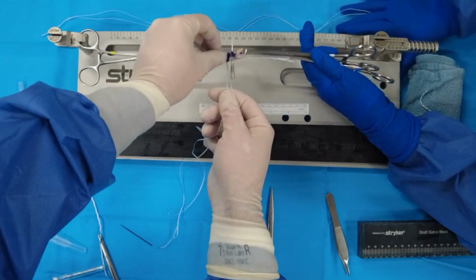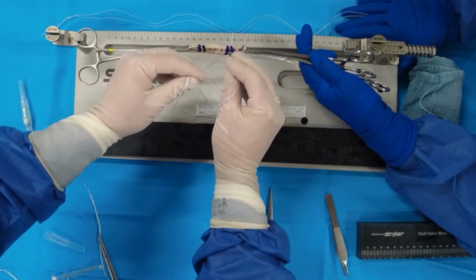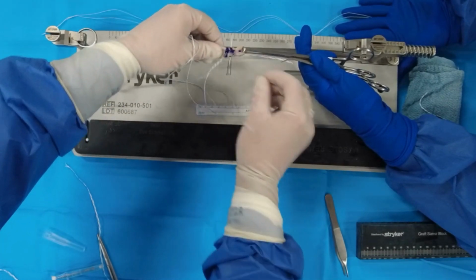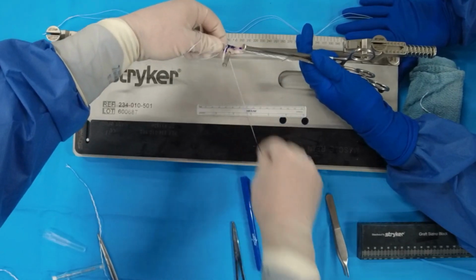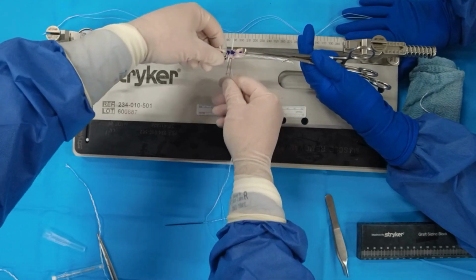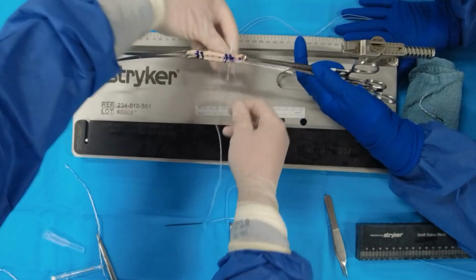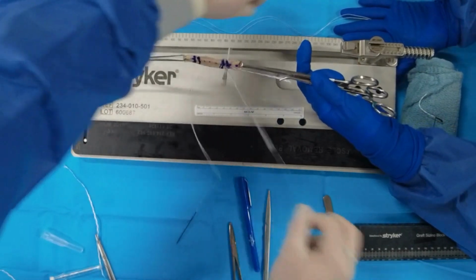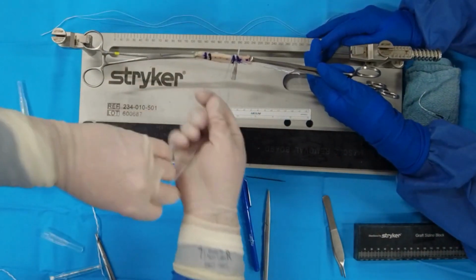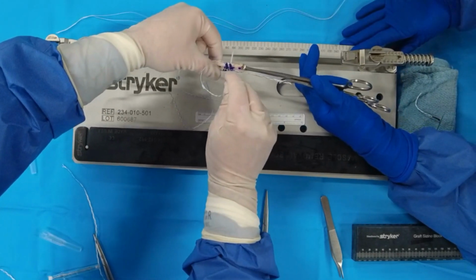And so we're going to start out, we're going to get 2 throws before the angiocath, and you're going to want to leave some space in between these as we're going to come back around to do our locking suture. But we'll place this and tension it, and the next pass we're going to go right up and tight against the angiocath, but not through it. And you can move the angiocath back and forth a bit just to verify that you haven't captured this and that we've left room for our future suspensory placement. But this, again, we're going to place right up against the angiocath. We're going to hop across the other side. The angiocath is really a safety feature in this technique.